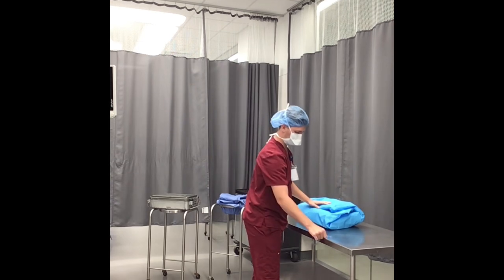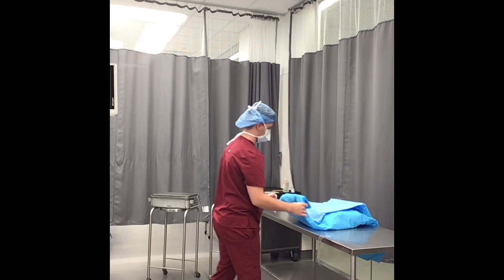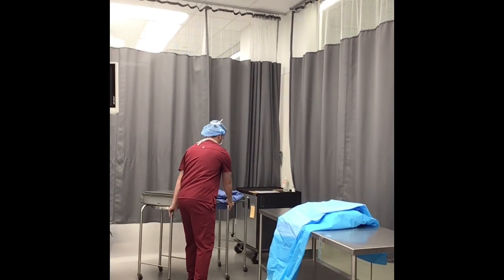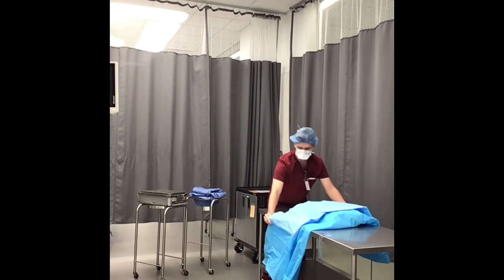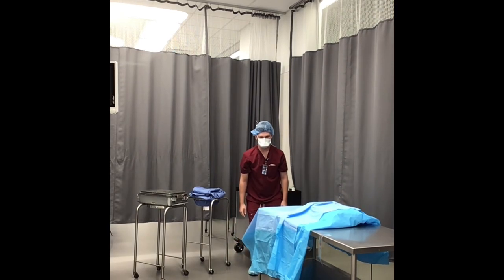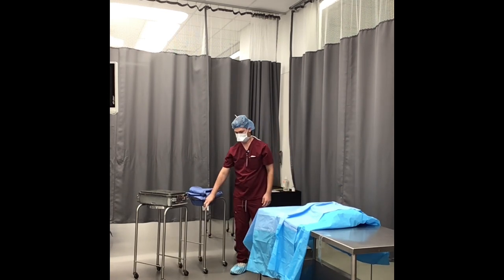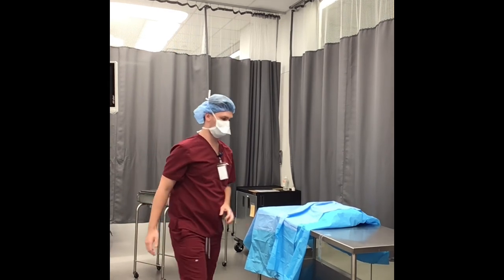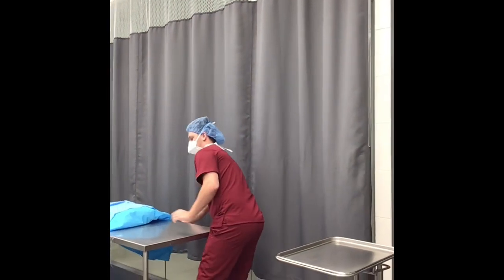So I'm going to take this tape off. The first flap is going to open up away from me. The second flap is going to open up towards me. Okay? Then I'm going to go ahead and step around. Again, creating space. Remember, everything's on wheels. Okay, so I'm reaching below table level here and pulling towards me. Notice how I'm bending at the knees and not the waist, because if I bend at the waist, then my head starts to come over the sterile field. Notice how I'm always facing my sterile field, maintaining 12 to 18 inches. Same thing on this side.